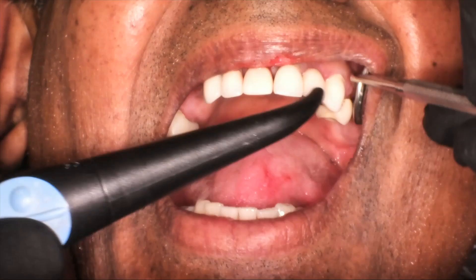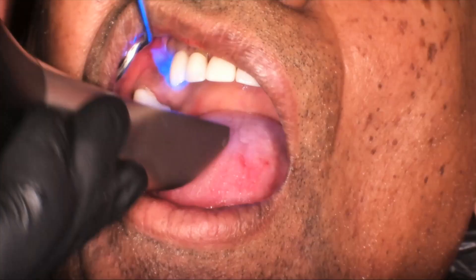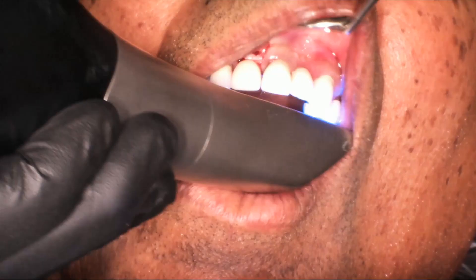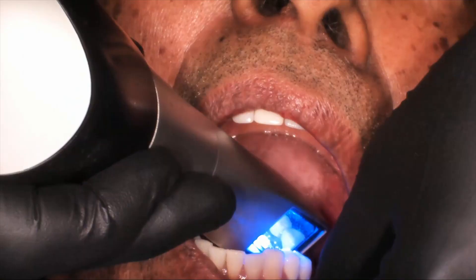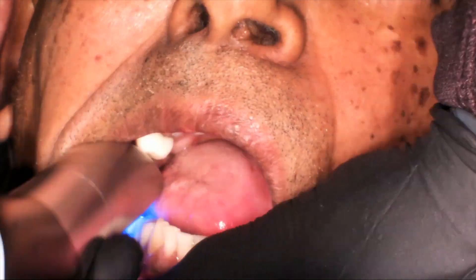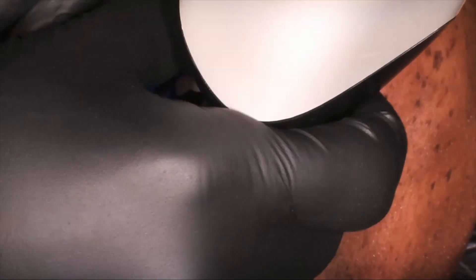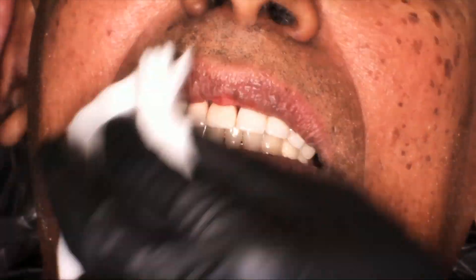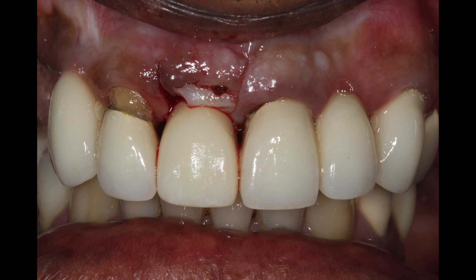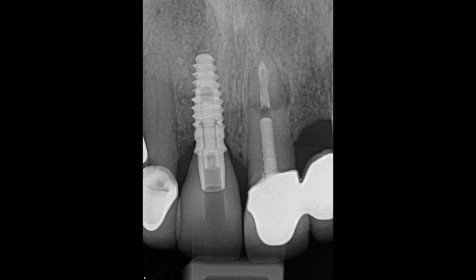Here we are — our patient is done. We've delivered our implant provisional, and now we're taking his implant records for the upper right hand side. We go ahead and take our digital impression so that we can get our patient ready for our next step, which is the upper right dental implants. All of our impressions — a bite, lower arch, upper arch — and here's a closeup photo of how we allowed the patient to leave that day. This will help form the tissue. And here's an x-ray showing us a nice emergence and bone respecting the bone.